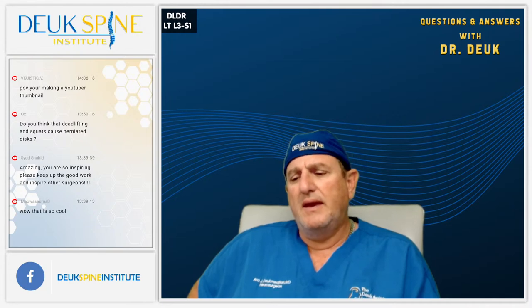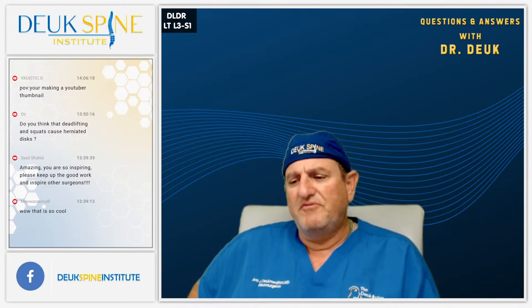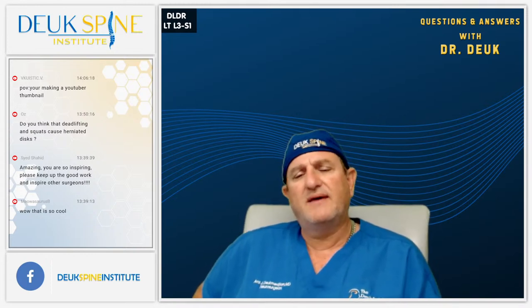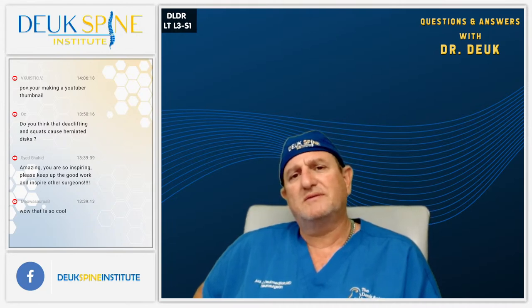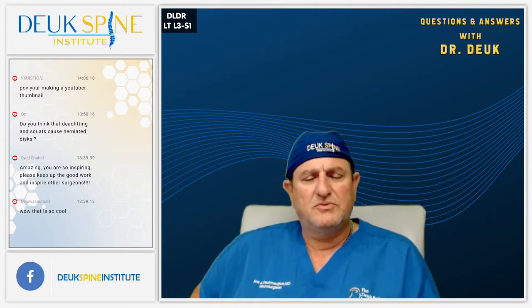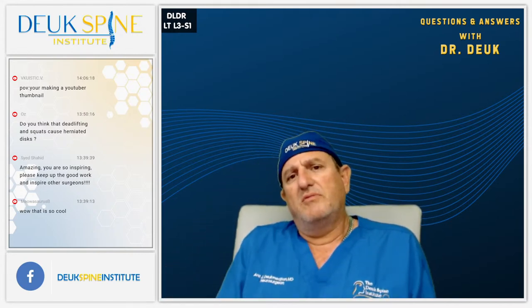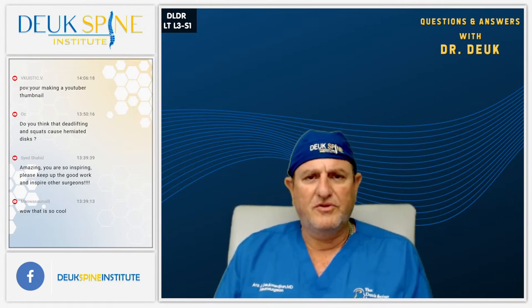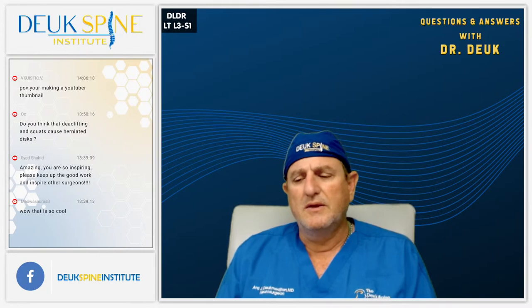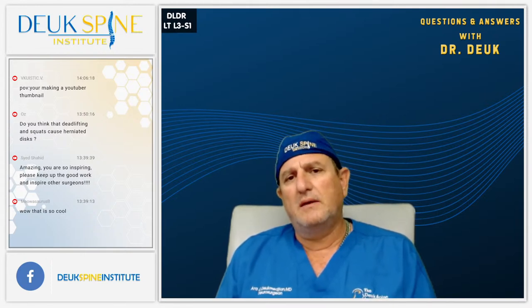But of course, it is a safety concern and one that we've been working on trying to figure out a better way to do it. So we found something very interesting. The patients that have CPAP machines, because they have moderate to severe obstructive sleep apnea, we don't have any issues with them. And we realized that if we took a patient who does not have obstructive sleep apnea and put a CPAP machine on them, we don't have any problems. They ventilate beautifully throughout the surgery and you can keep them really sedated. So we have purchased CPAP machines just for our patients having this procedure, and we started to use them.